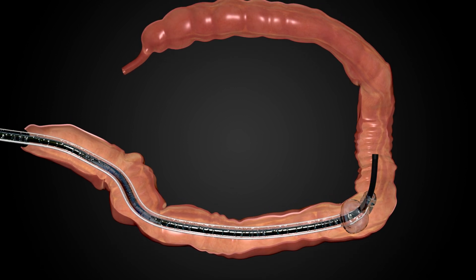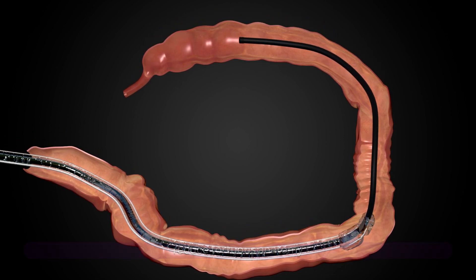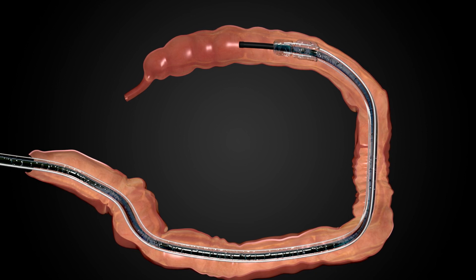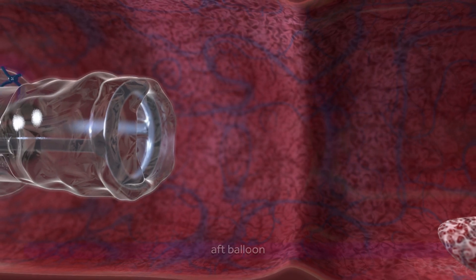Used in tandem, the endoscope and DiLumen can effectively reduce tortuous anatomy as the clinician navigates to the cecum. A reduced colon enables better control of instruments and the endoscope during therapeutic procedures.